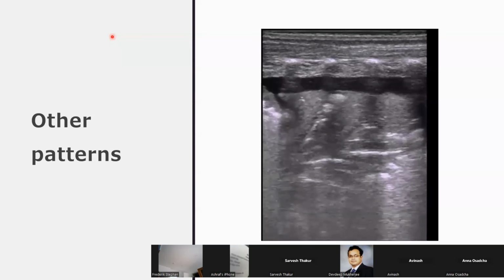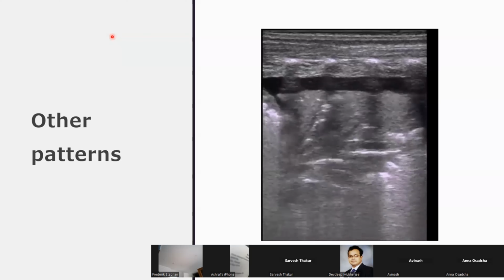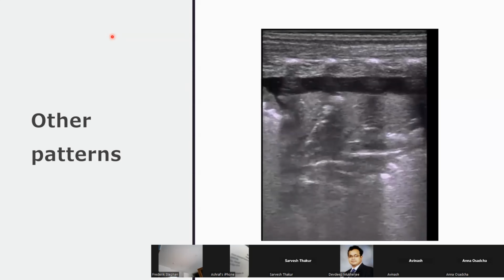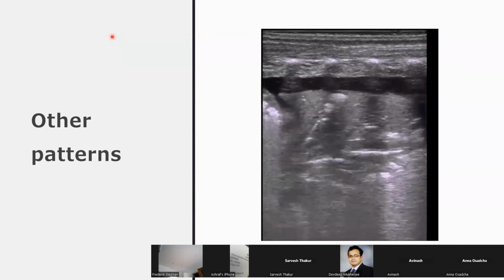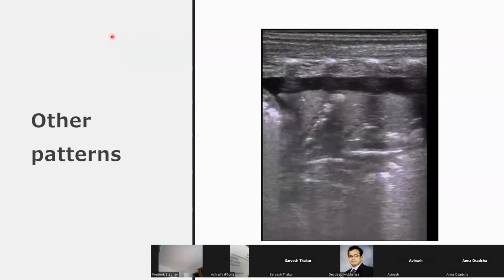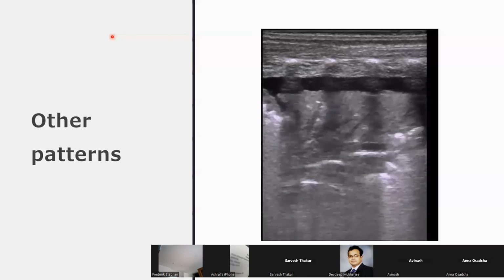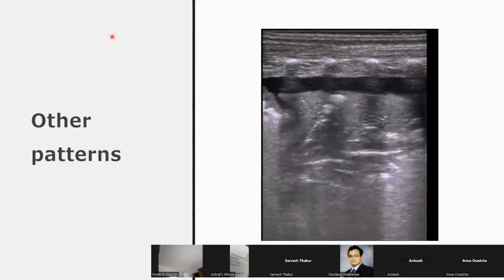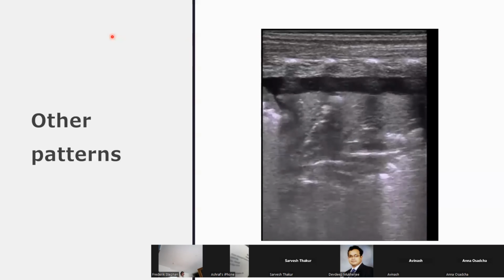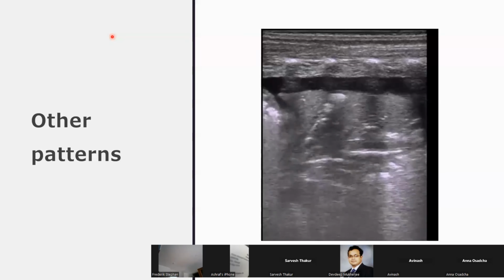So for recruitment purposes, as we have the atelectasis, we need to optimize the VG. Sorry, not on PEEP VG, can it be just pressure ventilated, 24/6? Only pressure ventilated.